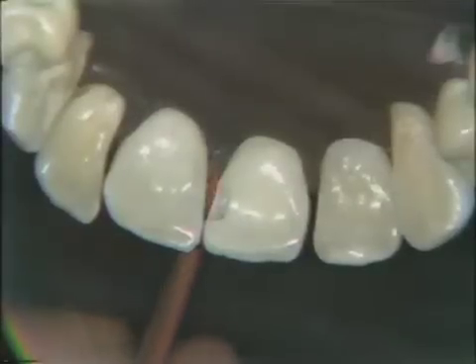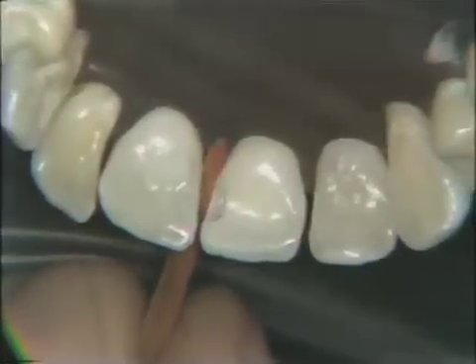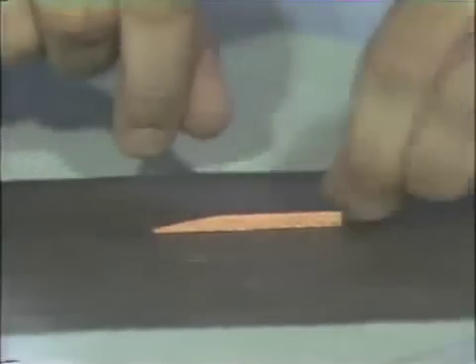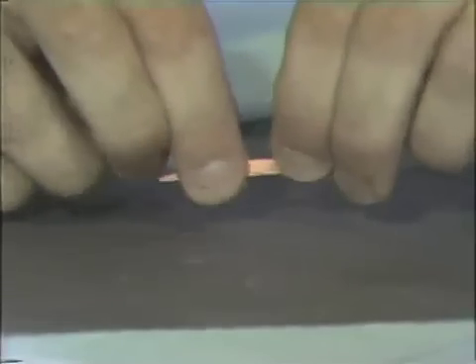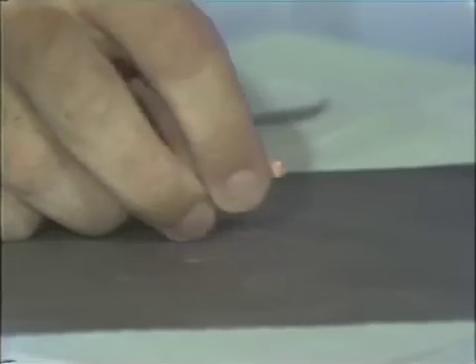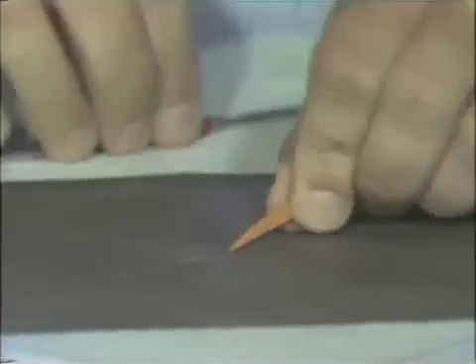So now we will pre-test this wedge. We want to see just where it will go. Once you mix your materials, you do not have time to do any guessing or trying. You have to know exactly what to do as you place the material. We don't need the full length of that.